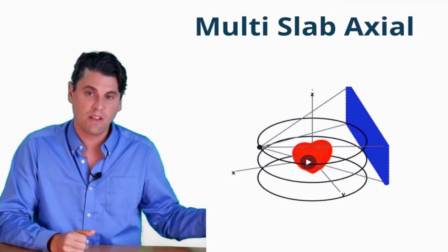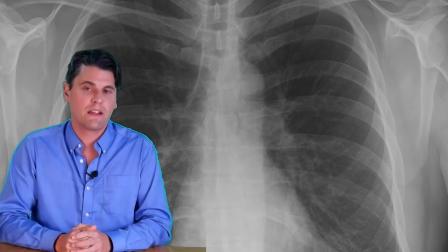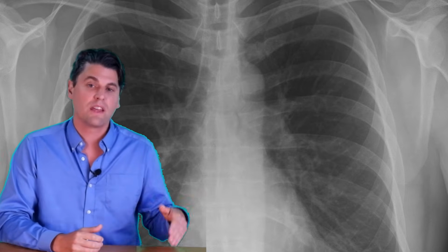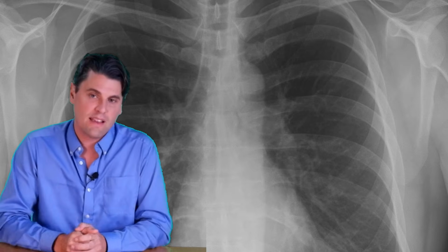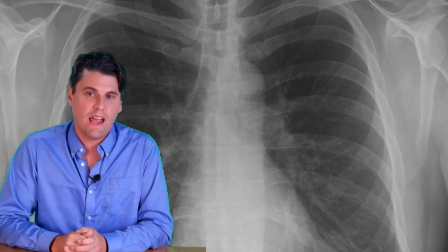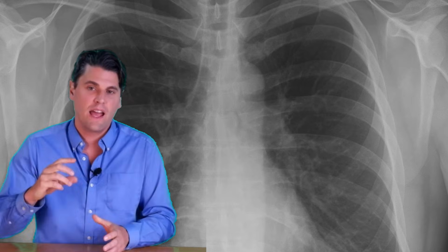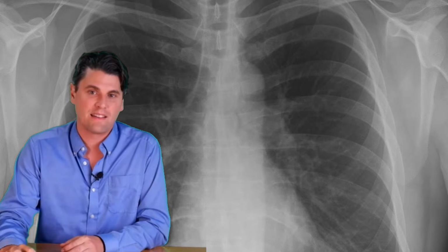That's different than traditional helical reconstruction, where there are opportunities to use redundant data. In the case of cardiac reconstruction, you're typically using the minimum amount of data available. So the helical acquisition for cardiac is relatively dose inefficient. So the multi-slab axial was a big improvement in dose efficiency. You still can have those same artifacts at the boundaries between the different slabs in multi-slab axial.